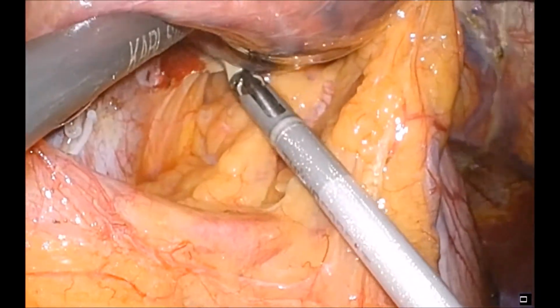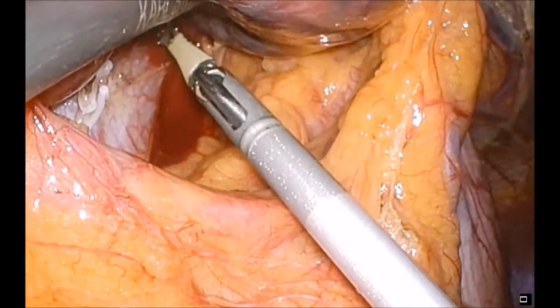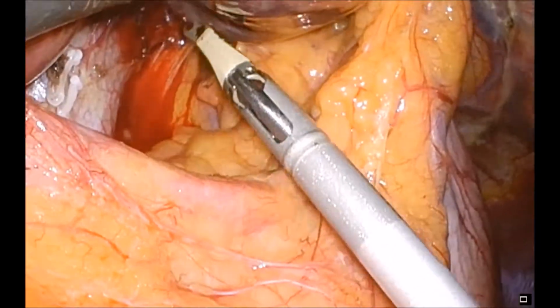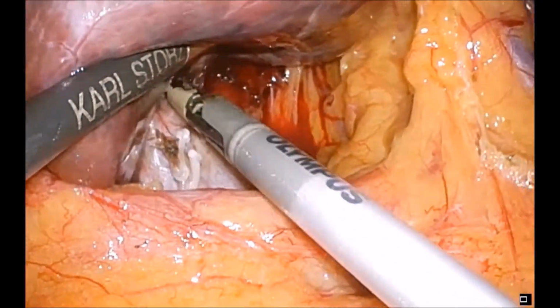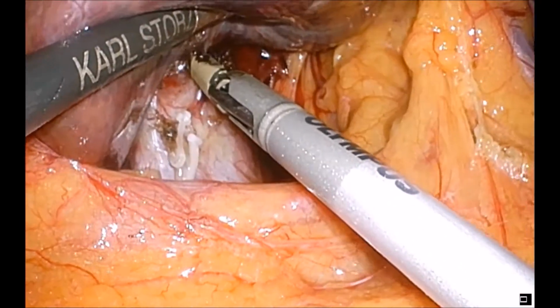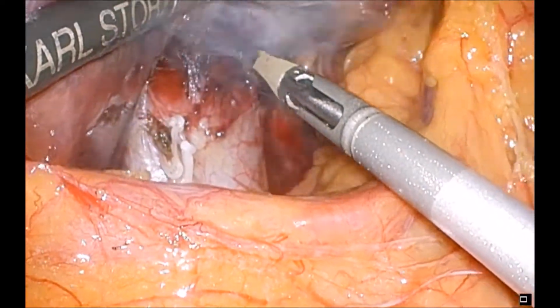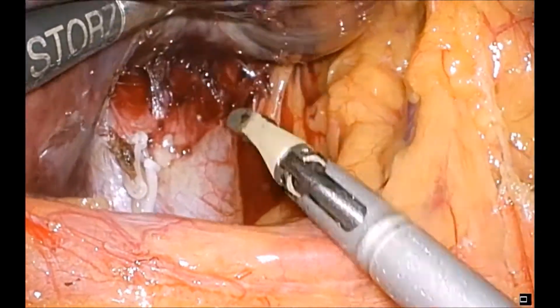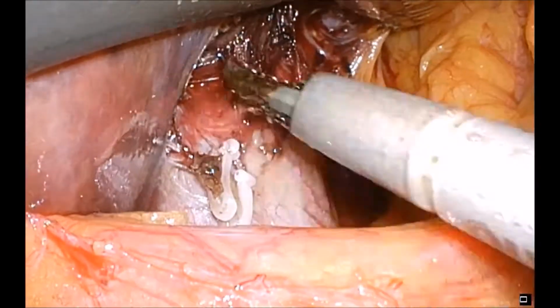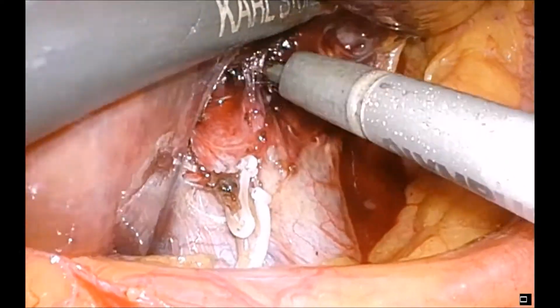Small caudate vessels there on the cava are taken, and one causes a little annoying bleed that's fairly readily controlled with bipolar diathermy in the end. Further dissection reveals further short hepatic vessels travelling from the caudate lobe directly into the inferior vena cava, and these are taken with locking hemoclips when they're of substantial size, and the very small ones have been dealt with bipolar diathermy through the Thunderbeat.